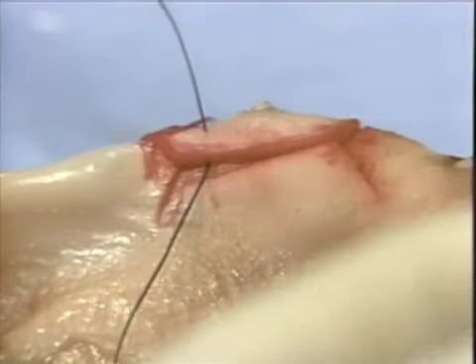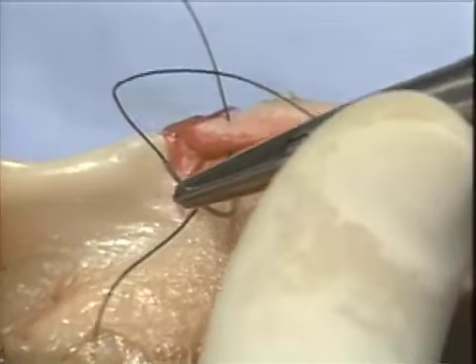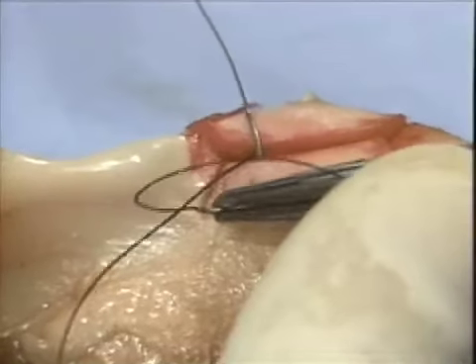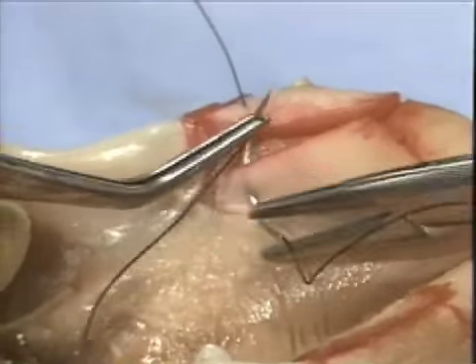Again, insertion of the suture into the oral side of the lingual flap, through to the tissue side. The suture needle exits through the incision, and the suture is eventually tied on the buccal flap.